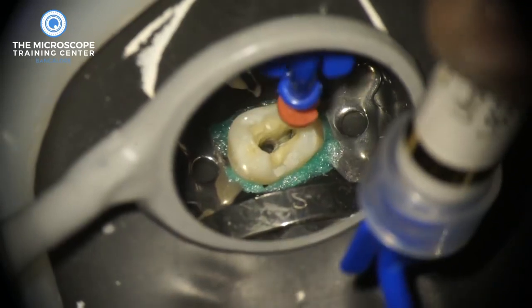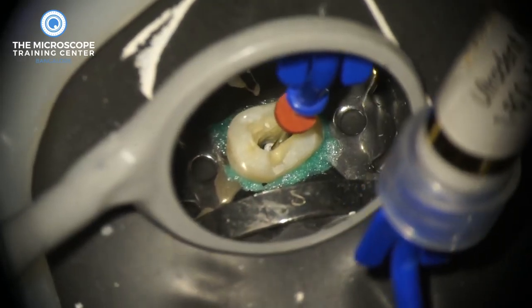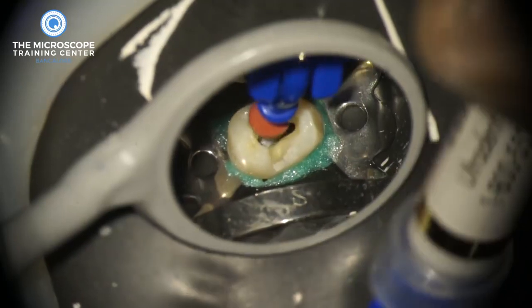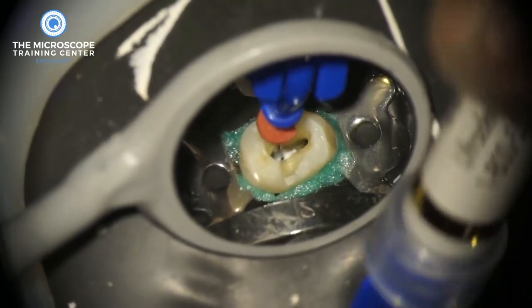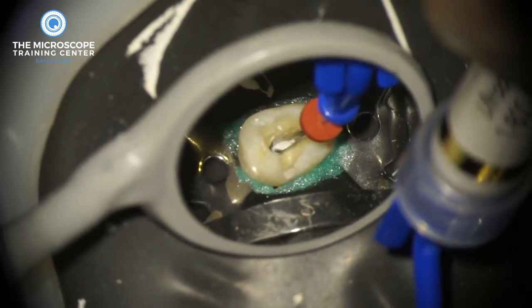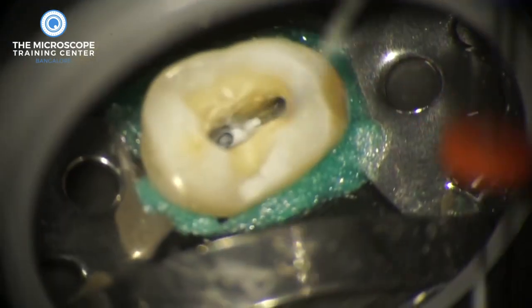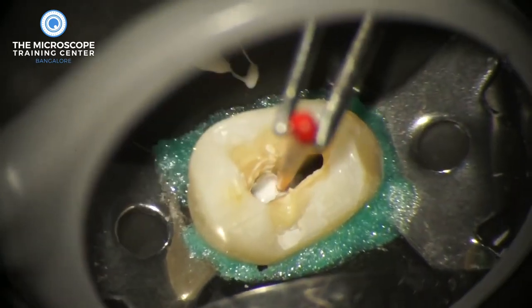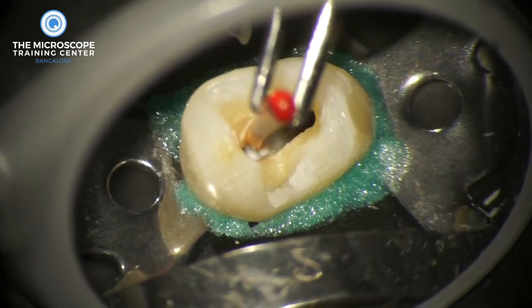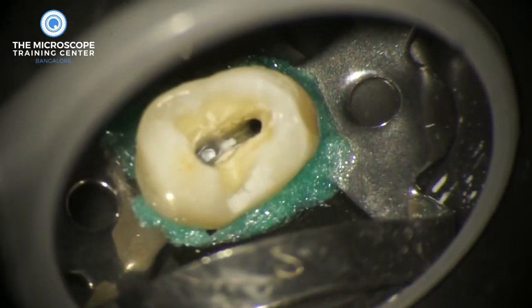Once you know the tip is moving freely up and down, inject a little bit of calcium hydroxide into the middle or coronal third. Then use the needle to carry it deeper into the canal. You inject a little bit in the middle or coronal third and push it deeper using the metal tip. We keep repeating this about four or five times until the entire middle or coronal third is filled. Then I like to take the master cone into the canal up to working length, which carries the calcium hydroxide all the way right up to the apex.